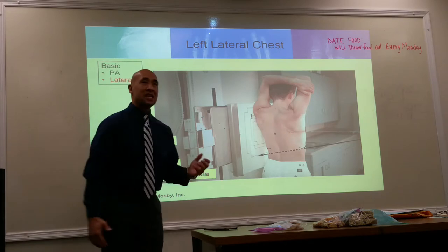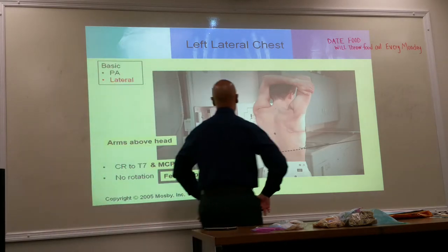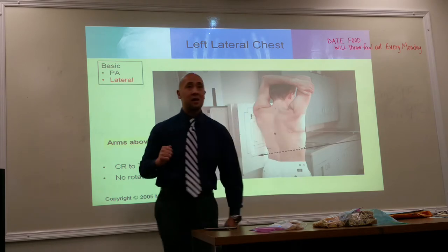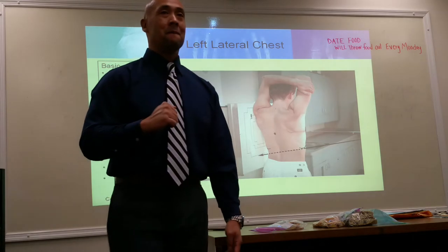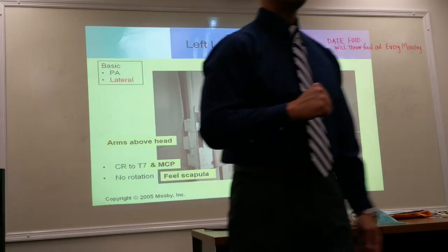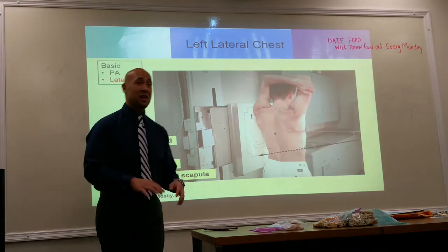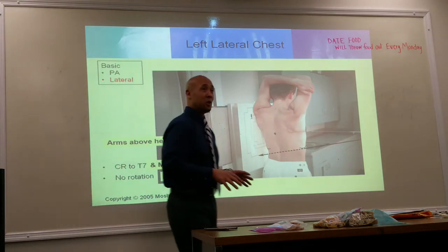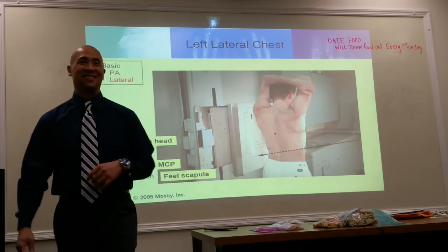Now, do I need to make any adjustments on my central ray? I already got it on my PA. Do I need to adjust my x-ray tube? No. It's already at T7, right? Is it already at T7? Yes, it's already at T7, right? That was actually, I usually don't do trick questions. That was a trick question. Okay, it's not on the test.